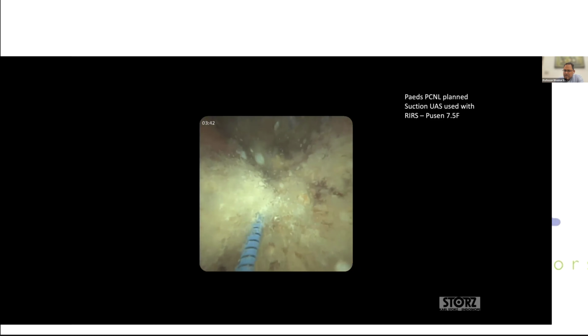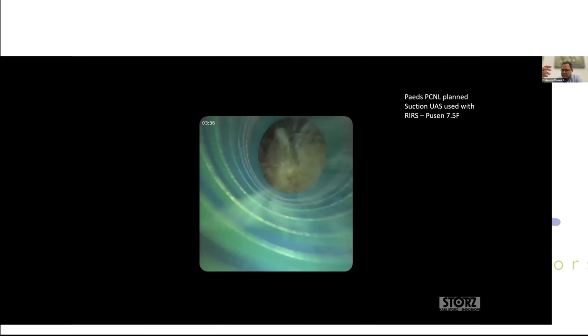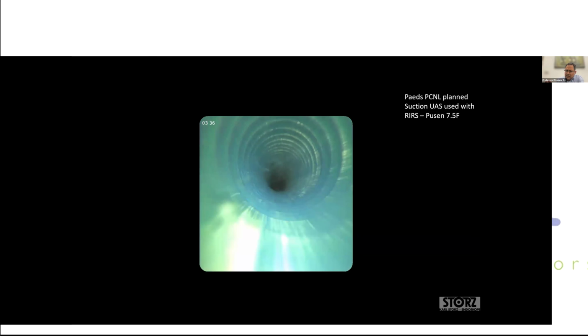So here, after you fragmented everything, and I usually try and fragment before I use the suction sheath, because if you try and do it intermittently, you then have to go back, fragment a bit, suck a bit. I don't like to do that. So I fragment everything I can, and now you can see all the fragments with suction coming out. And in there, we went in, it was completely clear for what would have otherwise been a PCNL. So you keep going in and out, and you keep sucking out fragments, bits from time to time, till you completely clear it.